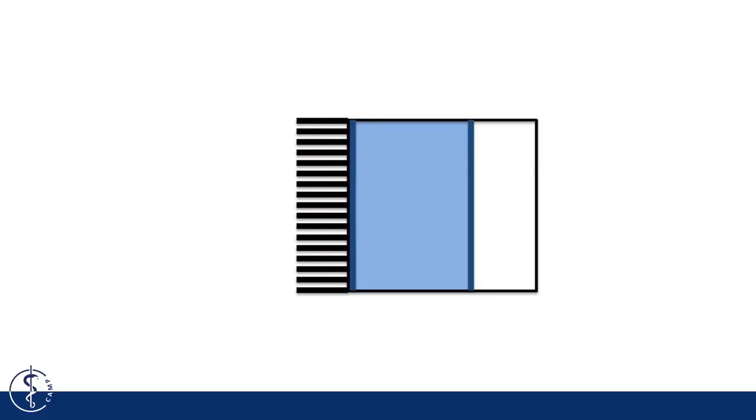But how does this work in hardware? A nuclear imaging device comprises several components. The most important part is the detector, which in the case of our drawing is a semiconductor crystal, here in blue, and is connected to the electrodes on either side. In front of the detector there is a collimator, which blocks all the photons not coming from a certain orientation. So suppose we have a radioactive source in front of our detector.